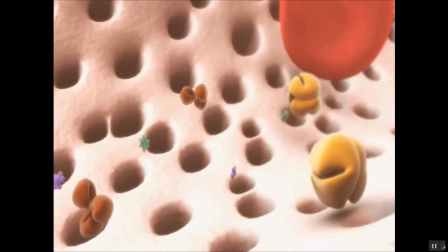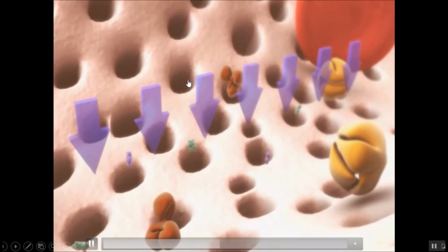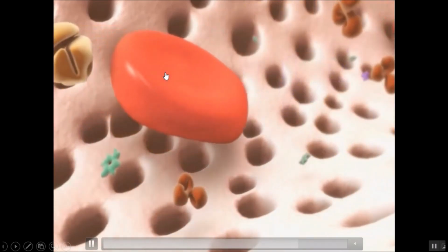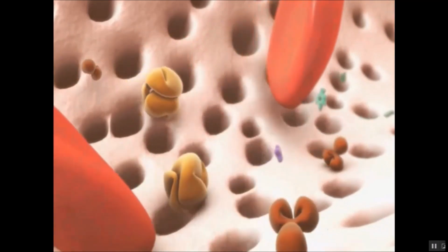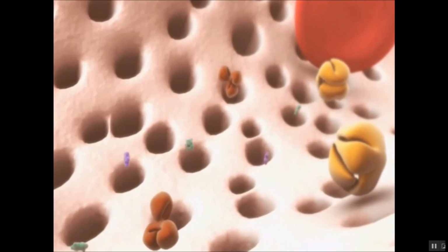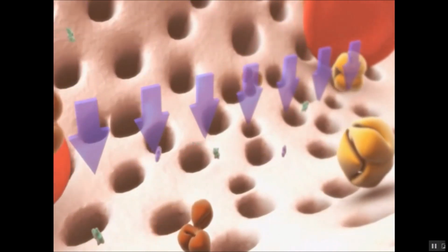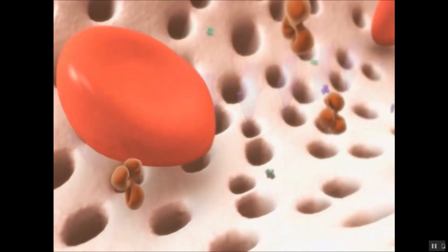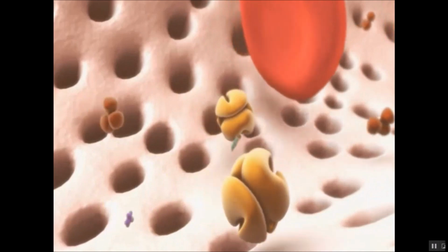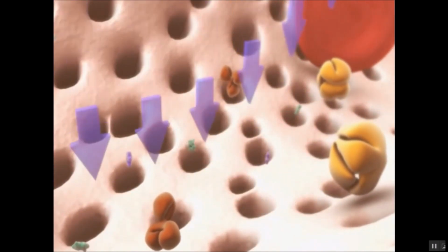The meaning of flux is that the porosity of the membrane can remove solutes with a definite molecular weight, while low flux only removes very small solutes. Medium flux, high flux, and superflux are three different additional membranes depending on how much molecular weight could be removed.